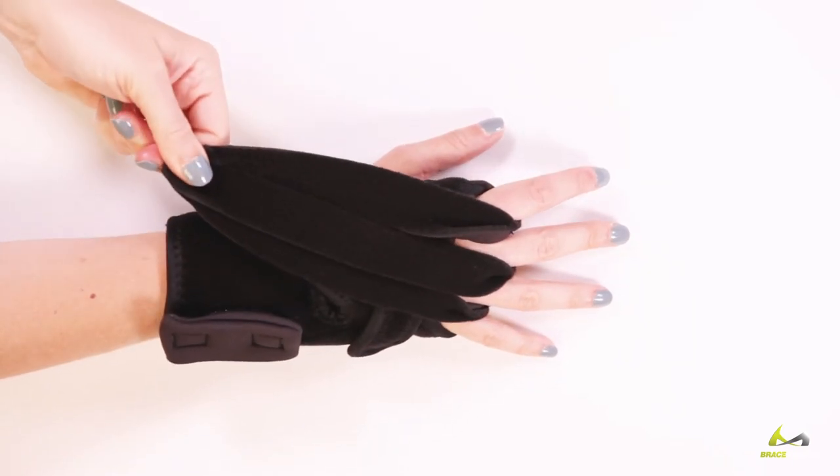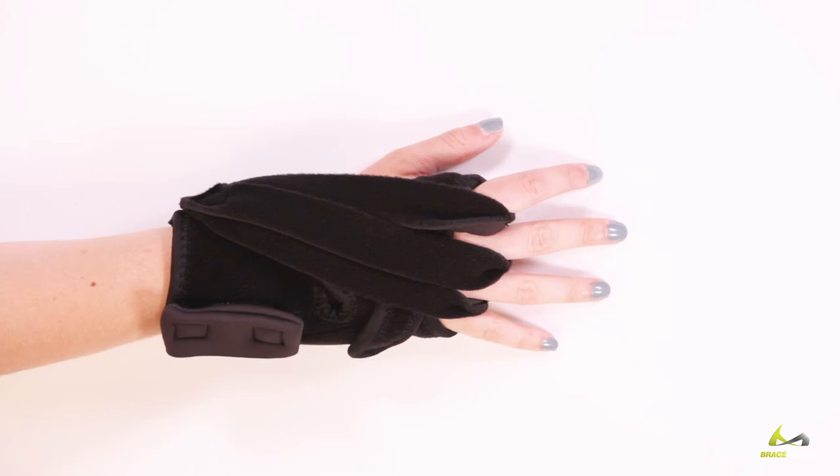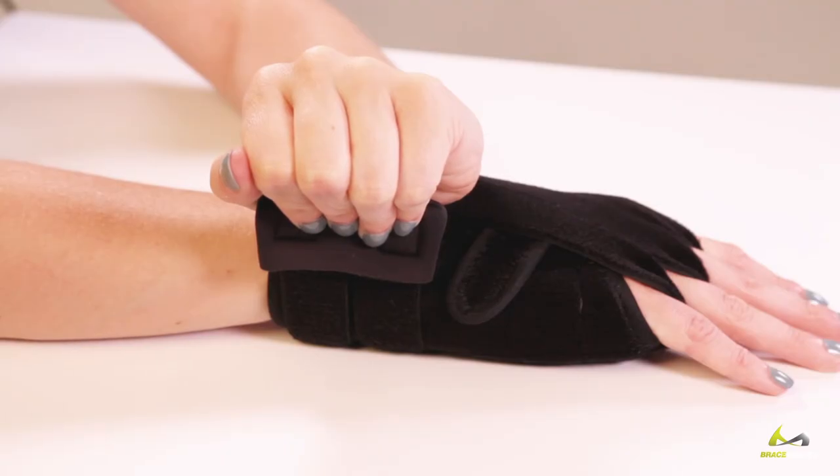How to apply: Finally, pull finger straps diagonally across the top of hand, attaching below the thumb. Gradually increase tension over time.